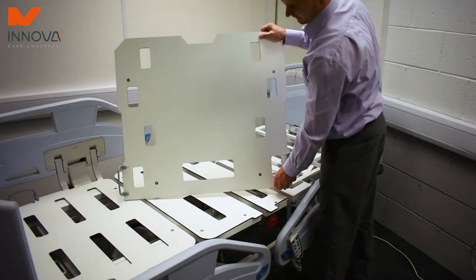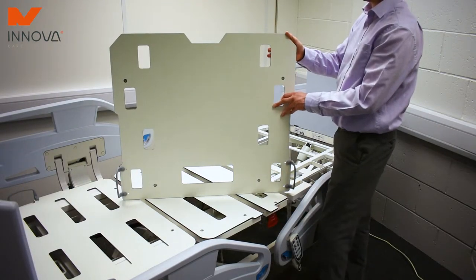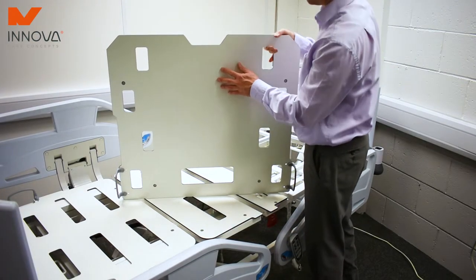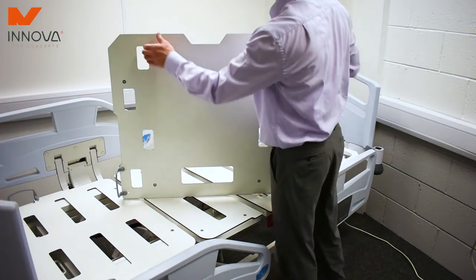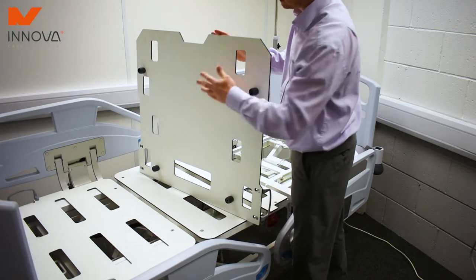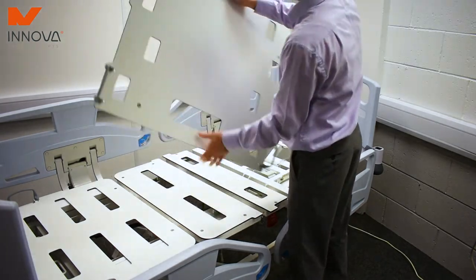One of the main benefits of the HPL plate and the fact that it's removable is infection control. Any ingress or bodily fluids can easily be wiped away and cleaned, and again made sterile on the back as well. It's the same composite — you can easily wipe it down and clean it.